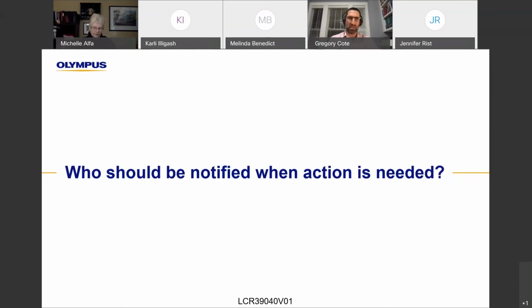We'll discuss the concept of reprocessing, culturing, and what to do if you have a damaged piece of equipment, because that can lead to this issue as well. So those types of things all need to be evaluated. But obviously, this is the objective of a culturing program: to potentially identify a hole or a gap in your process that led to this culture. It may be a personnel adjustment or retraining. It may be something to do with handling of the piece of equipment, and it may be that the piece of equipment itself needs to be assessed, evaluated or repaired.